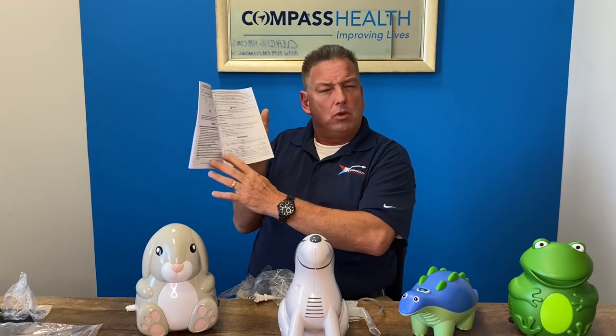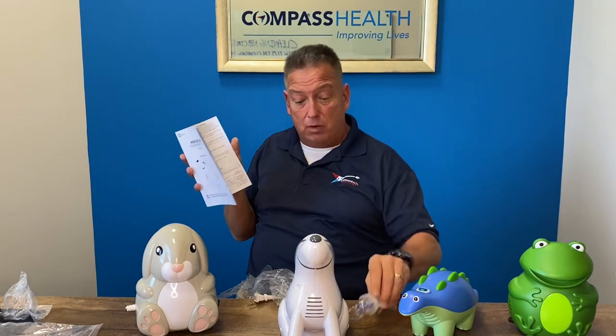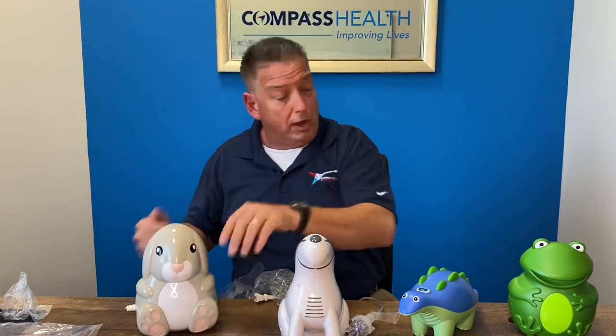Whether it's a carry bag or that type of accessory, the replacement medicine cups are available — all that good stuff. So there you are, the Roscoe Medical line of pediatric nebulizer compressors. Thank you very much.